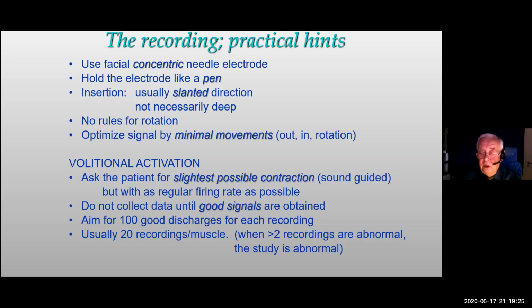I spend a few extra seconds to get good signals, and then we start the signal collection. We do not do much editing afterwards. I nearly do no editing, but we go on recording until we have good signals, and I want to have 100 discharges for each recording. With a frequency of 10 hertz, which is normal, it takes 10 seconds to record a good signal. And if we don't get it good there, we go on for 10 seconds more.